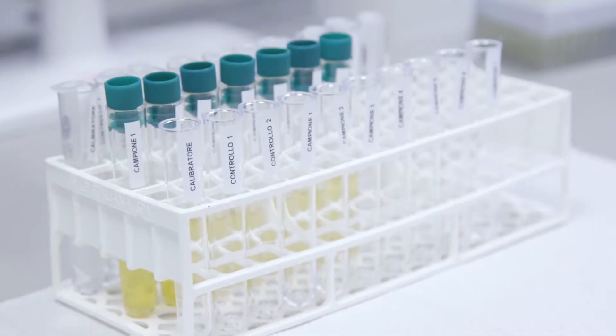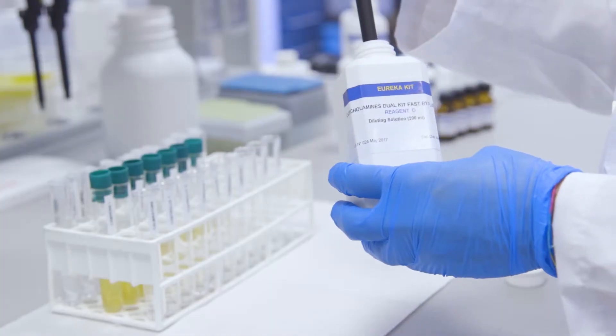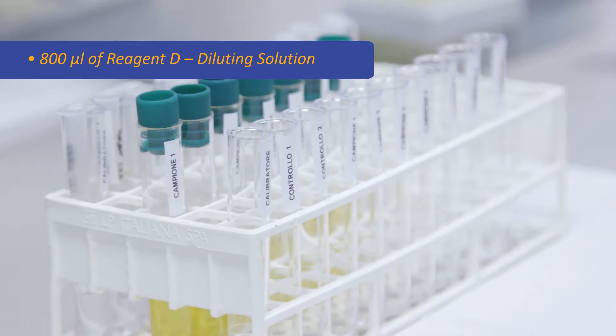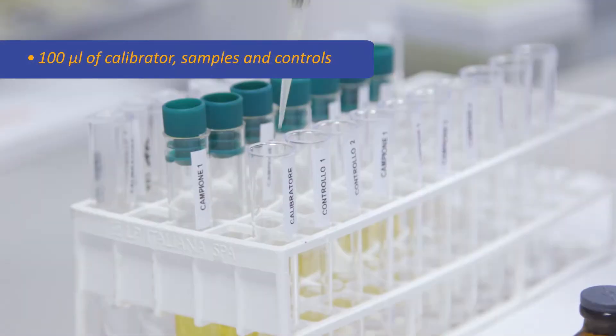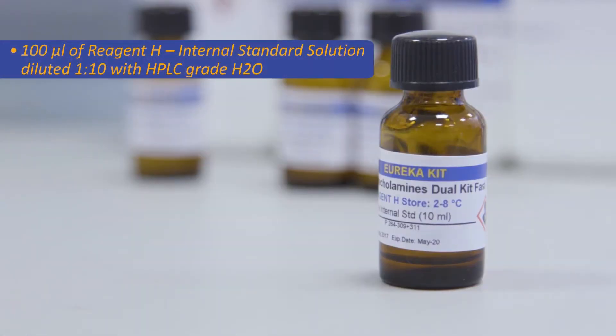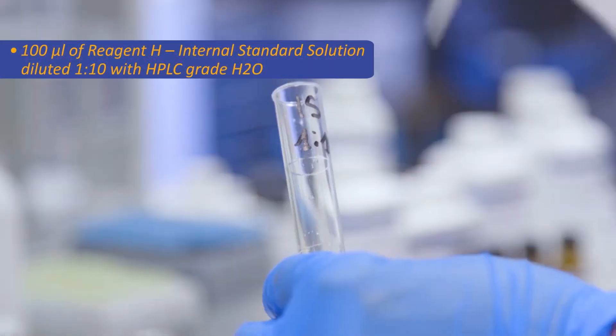Now we dispense in sequence in all the tubes: 800 microliters of reagent D diluting solution, 100 microliters of calibrator samples and controls, and 100 microliters of reagent H.